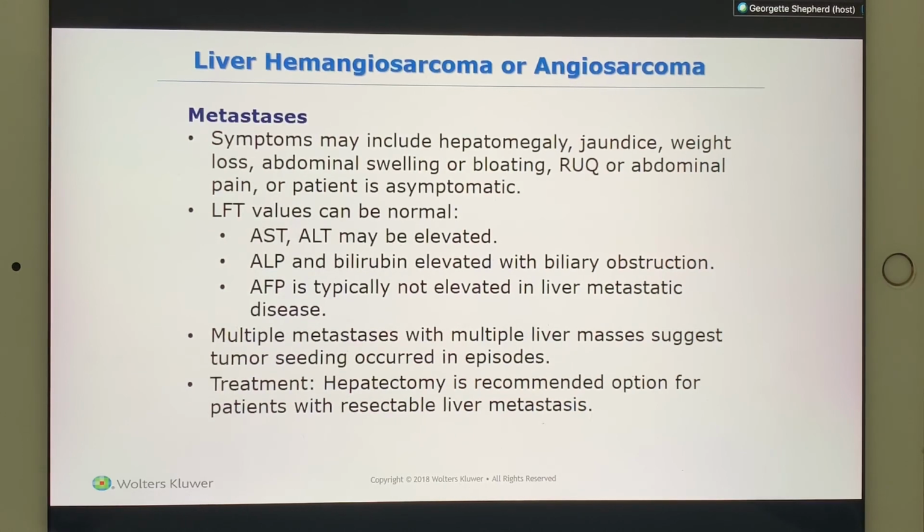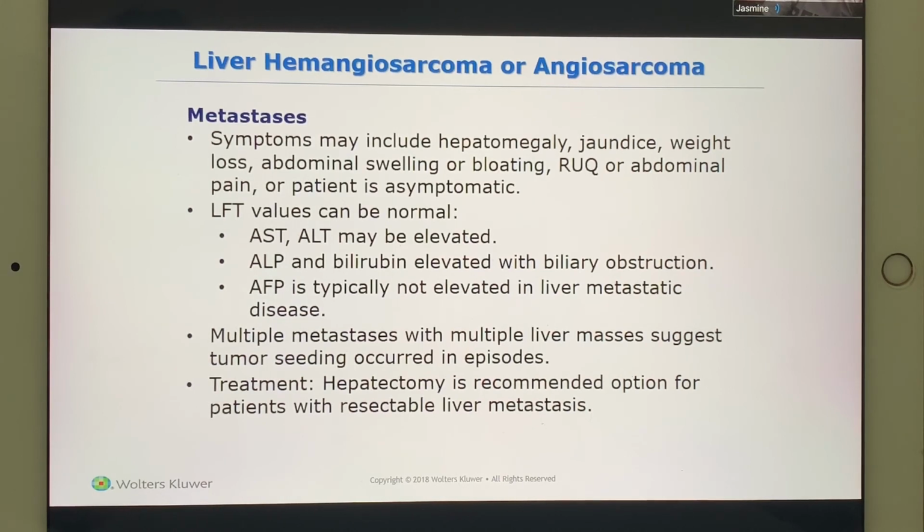Ms. Shepherd, when we are doing our notes, are we more so saying heterogeneous or homogeneous? Are we more so just describing what we see? That's the only thing we do. We don't guess what it is. Some facilities will make you do a differential, if it's not this, it's this.